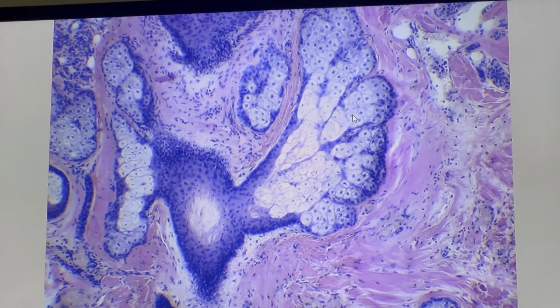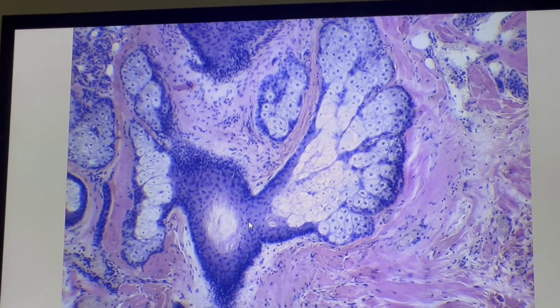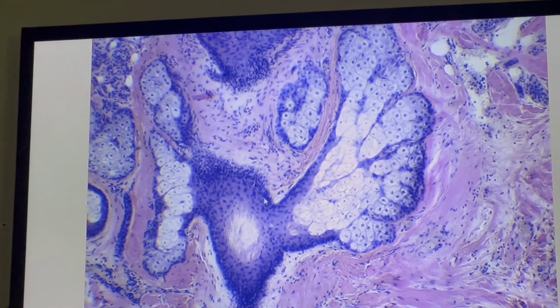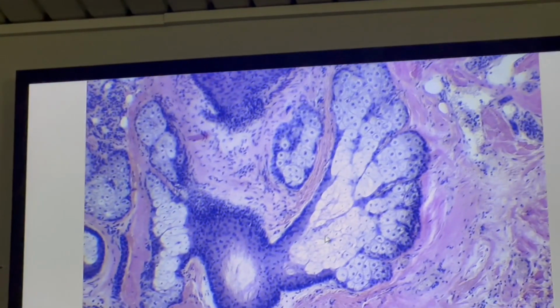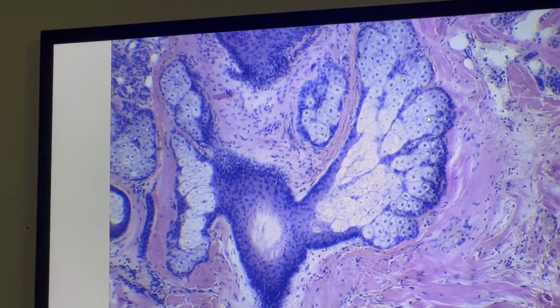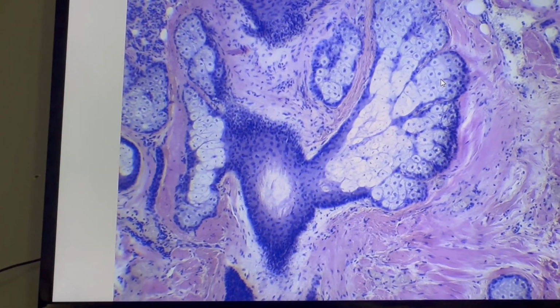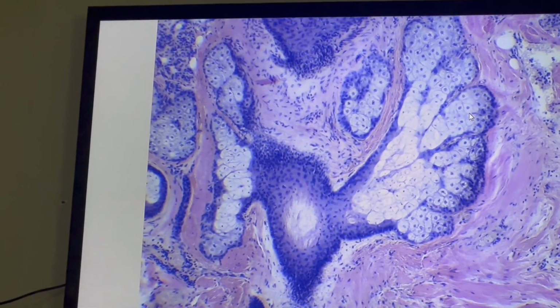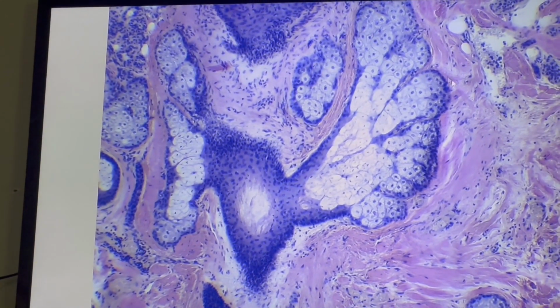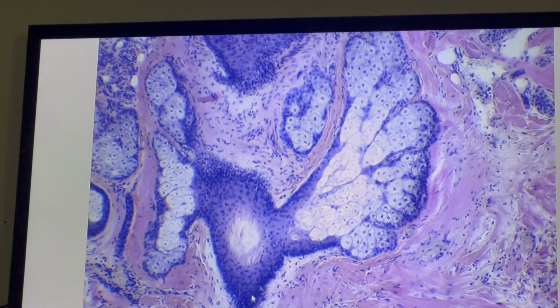The sebaceous gland has a short duct that opens into the proximal portion of the hair follicle. This structure is called the hair follicle, and this is the duct of the sebaceous gland. Each rounded cell is called a sebocyte, and the secretion is called sebum. Branched acinar glands, with short ducts opening into the hair follicle.